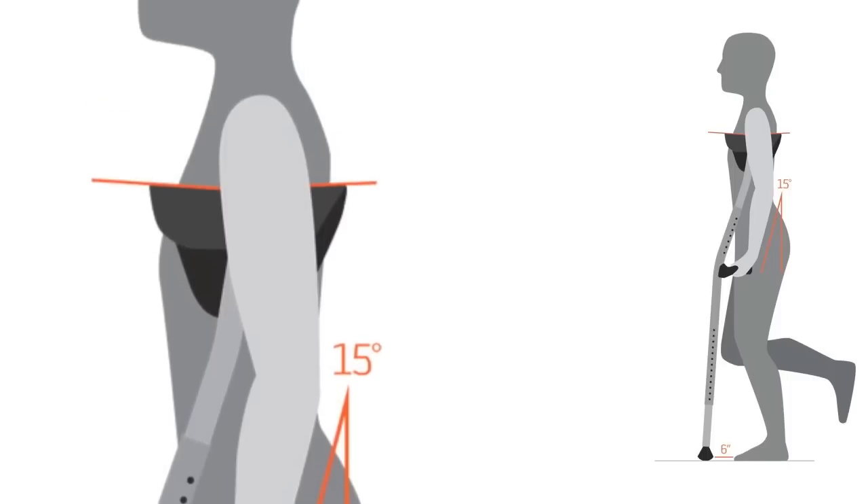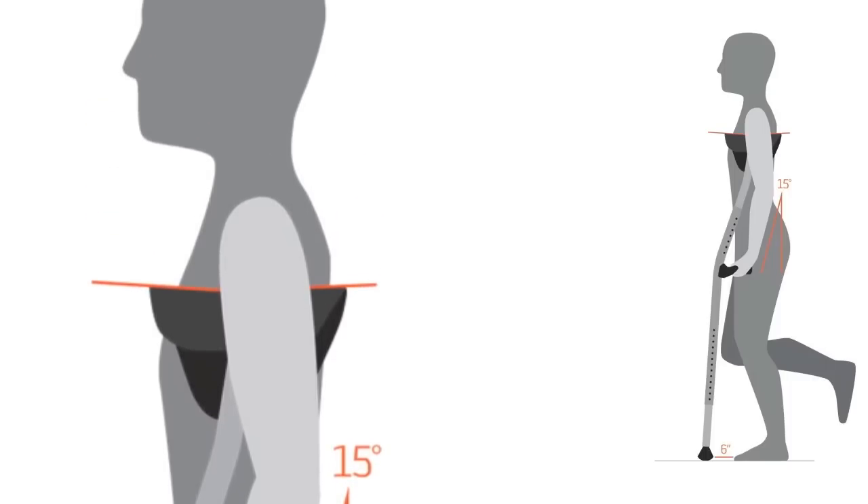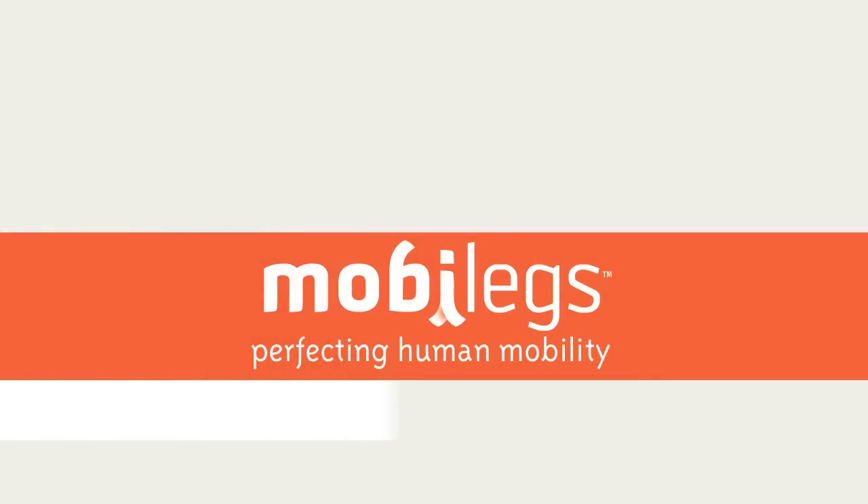Your arm should not be fully extended. If you have any questions or concerns about adjusting your MobiLex, please speak with your health care provider or a MobiLex distributor in your area.